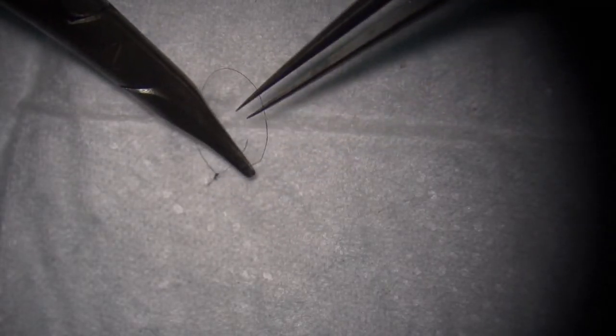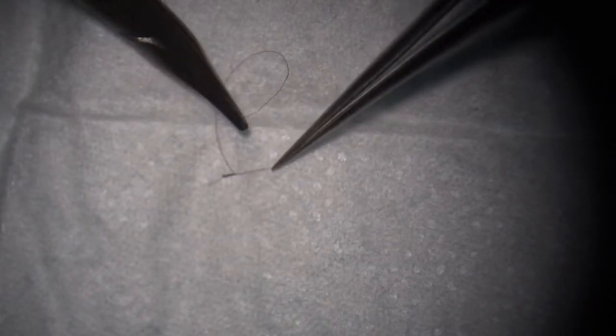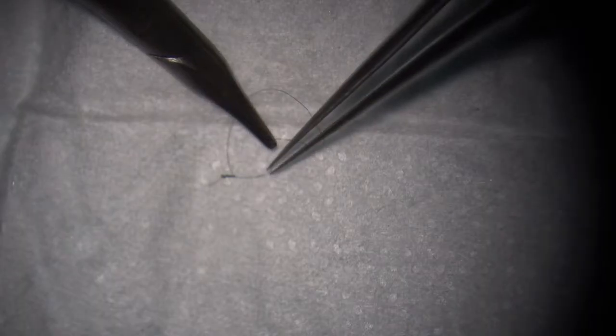Yeah, and then when you're getting better, there's another way of tying knots. See, I can control the short end. And you're right just above it. So this is the airborne method. With the airborne method, we can let go of the short end momentarily and then just pick it up. But the short end won't fall down and attach to the resting surface. Once it attaches to the surface, it's hard to pick up. So this method can make you more efficient. Our residents, once they get this method, it becomes their only method of tying knots.